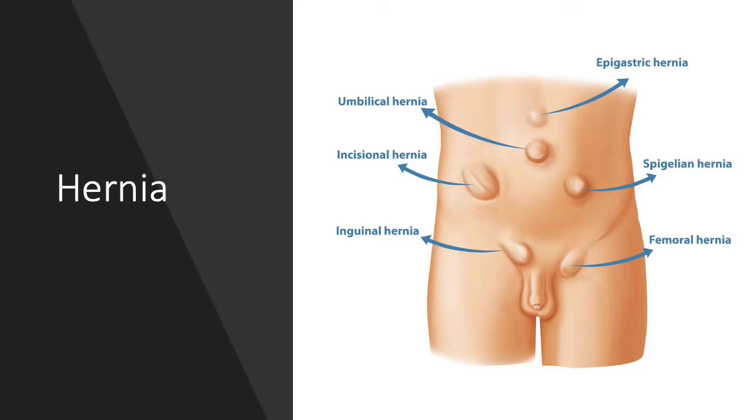The good thing about ultrasound is that because the hernia is very much positional dependent, you may find that the lump gets larger when you strain or you stand up. Therefore with ultrasound, as it's a dynamic test, we will typically ask you to apply pressure into your abdomen to make any lumps and hernias stick out much more, and this makes our confidence in diagnosing them much more than, say, other modalities such as MRI.